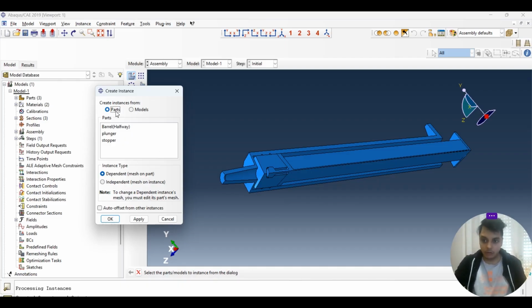Whenever I talk about instances, make sure you understand what dependent mesh means. If you have to mesh one part and that is related to a whole assembly, then you can use a dependent part. Independent means, let's say you want to mesh 100 bolts and each and every one has to have a different mesh, then this is where you choose an independent mesh. But if you have 100 bolts and all have a similar mesh, then choose dependent. In that case, you don't have to mesh each and every bolt, you only have to mesh one, and everything will get updated. This is exactly how we decide which one to choose.